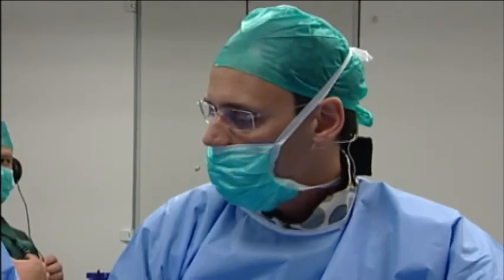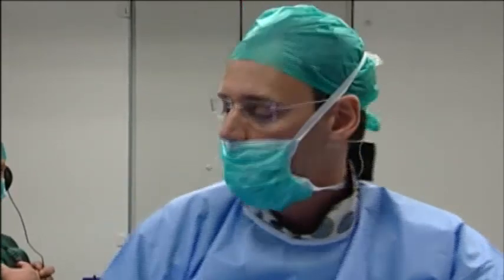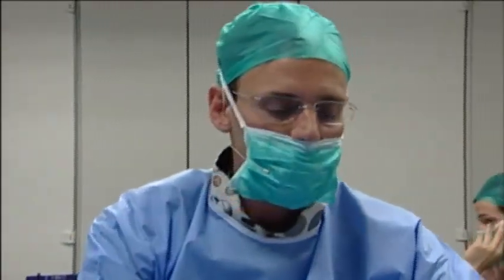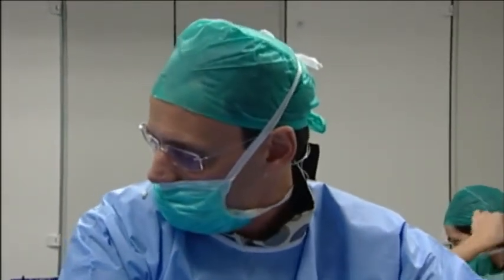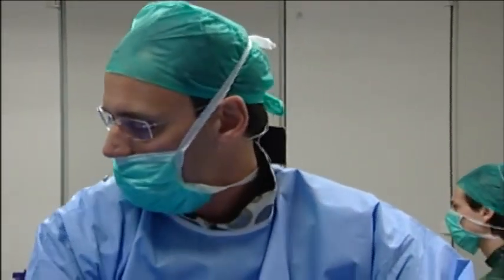The 22 millimeter device goes through 10 French, but in order to have some more room, just in case I need to use a larger device, I picked up a 13 French sheath. So Rodolfo is holding the wire. I'm rotating the sheath. It went through the skin and subcutaneous tissue easily.